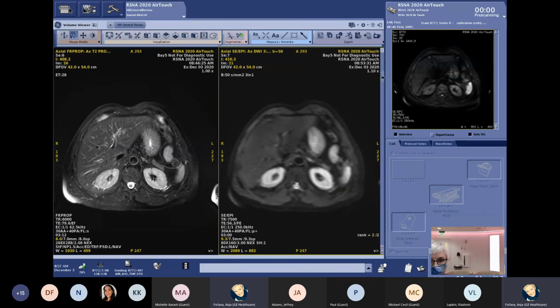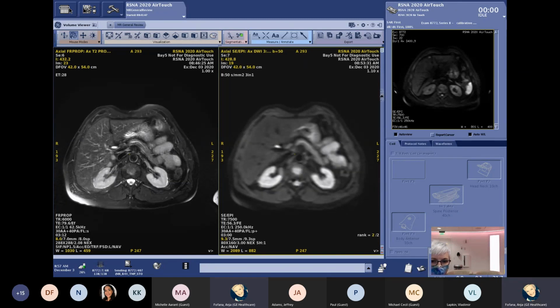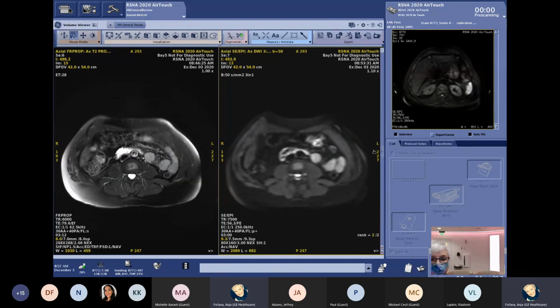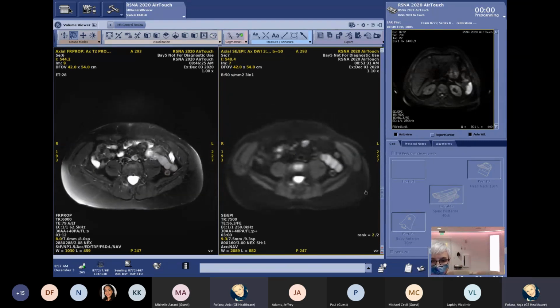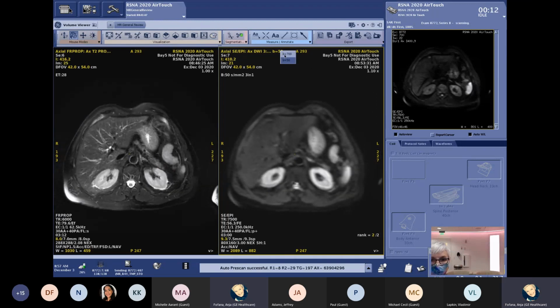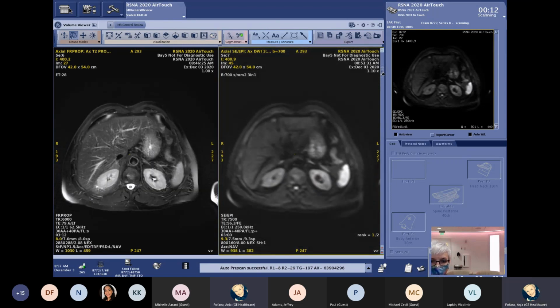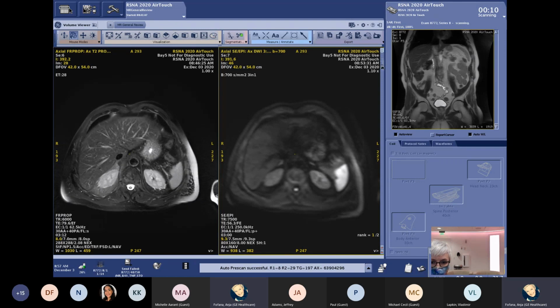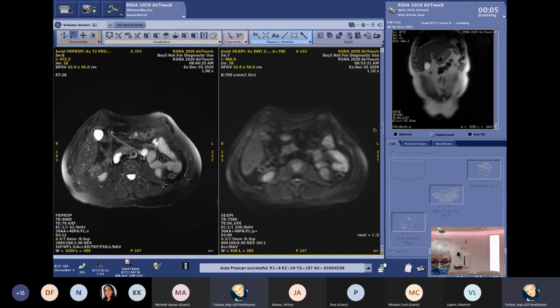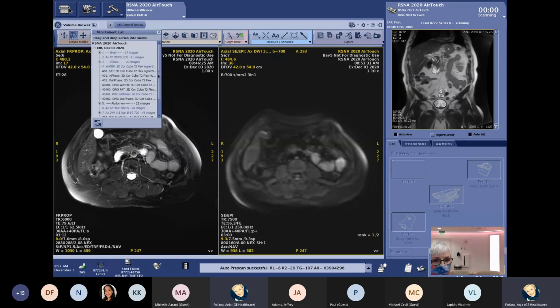So we do see that there is really less distortion in these images, and that it's really nice because it was using the navigator technique, so we don't have to worry about breathing artifacts and such. And then I'm going up to the higher B value because that is the one you want to challenge me on, because the higher B values are the ones that usually tend to have less signal. But as you can see, that sequence also has a lot of signal here.